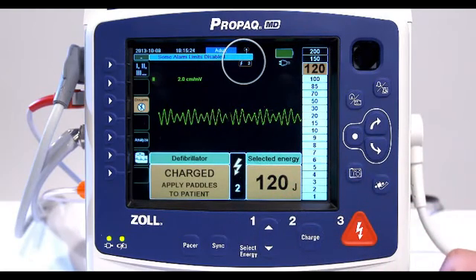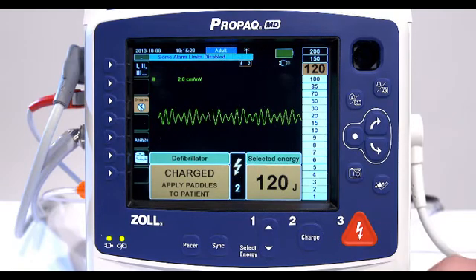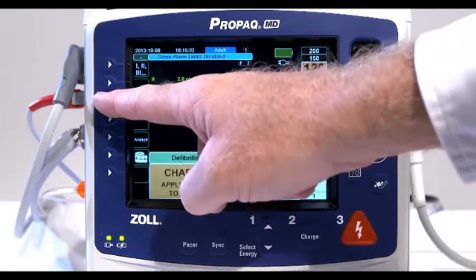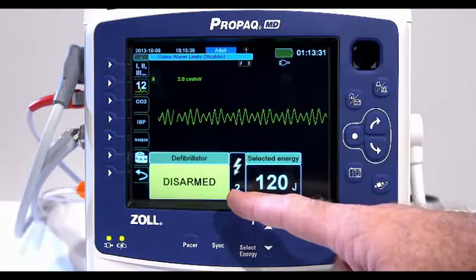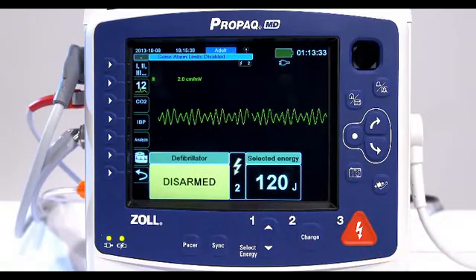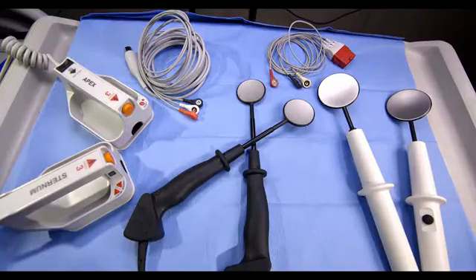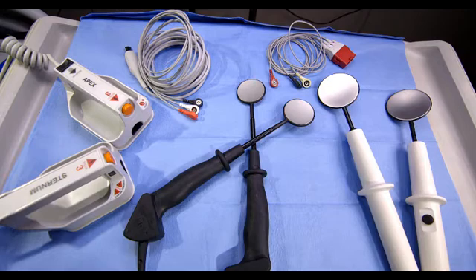Pressing the front panel shock button instead of the paddle shock buttons will produce an audible invalid operation tone. The delivered energy level is displayed at the bottom of the screen and the shock number displays at the top of the screen and in the defib control panel. If at any time you want to cancel the defibrillation, press the disarm quick access key. If the defibrillator is not discharged within 60 seconds after reaching the selected energy level, the unit automatically disarms itself.